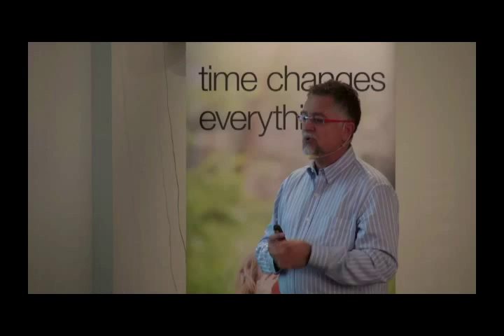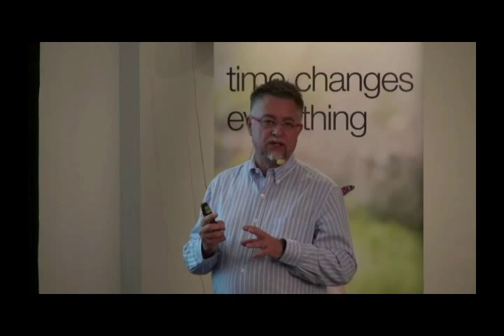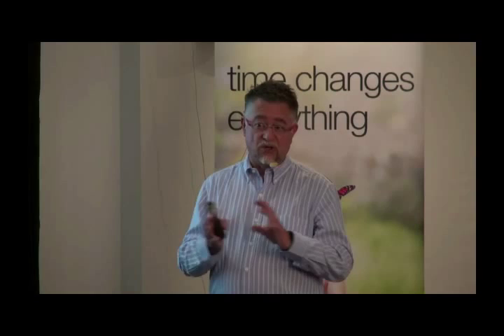So again, remember, it goes back to the way these instruments work. They do a red cell run first, okay? And the instrument is trained to say, if I am doing a red cell run and I see something big and round that glows, I'm going to call it a reticulocyte, okay? Because there are never that many white cells, so I have to call it a reticulocyte. Does that make sense, you guys?